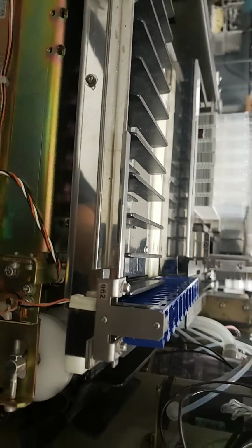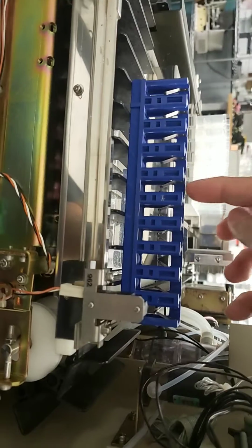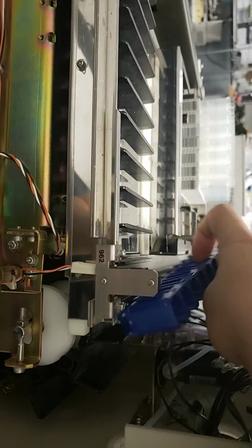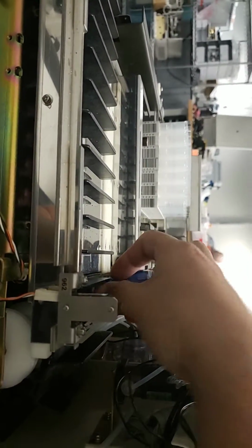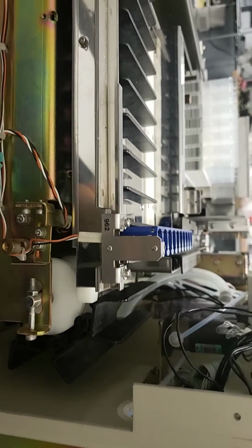And like I said, the best way to test this is putting a whole bunch of racks on with just front heavy. So you want to put, like, 3 tubes, 4 tubes just in the front with DI water. That way it's front heavy. That way it causes the most likelihood to fail. So if it gets this back corner, we'll know pretty quickly if it is lifting off that belt there, because the weight is all in the front. And if it can't handle front weight, then the alignment needs to be tweaked just a little bit more. So there you go.